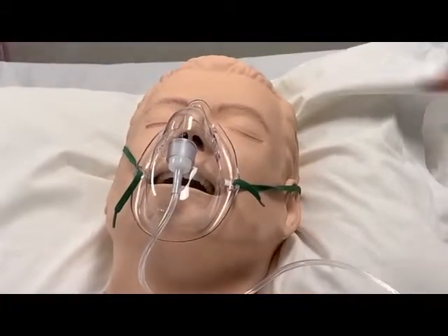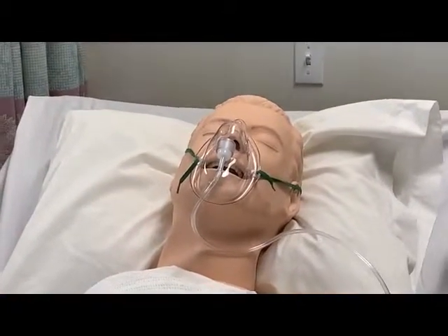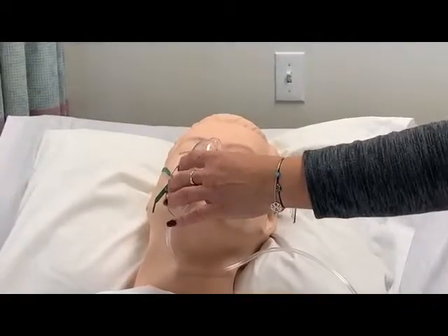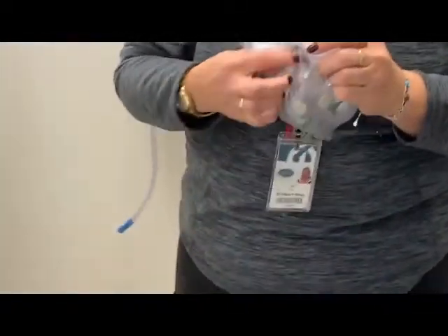So that would be the application of a Simple Mask. Again, 35 to 50%, liter flows 5 to 10 liters per minute. And that would be based on your patient's breathing pattern. I'm going to go ahead and take this off, and we'll move on to the non-rebreather.